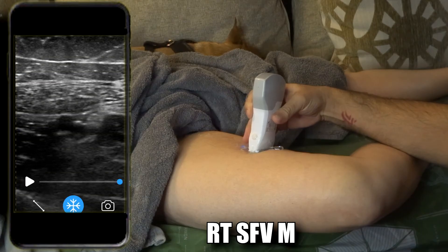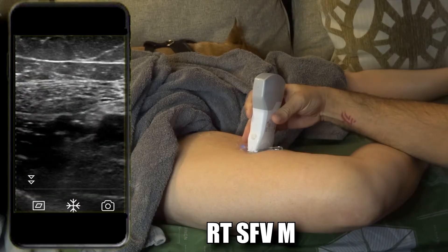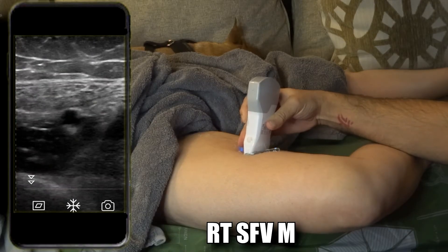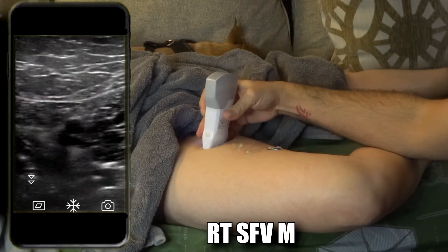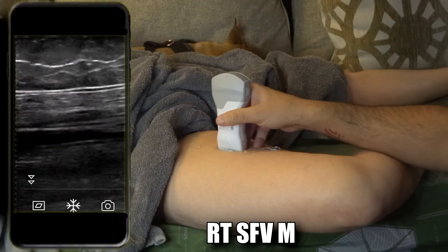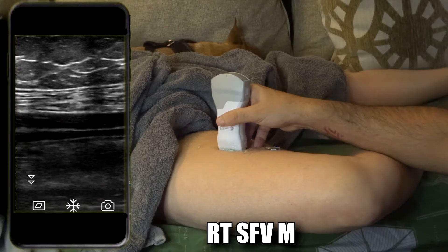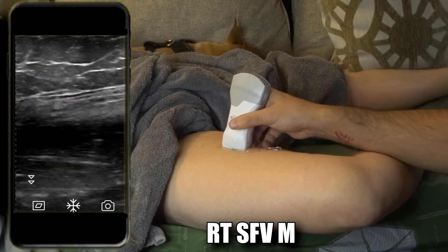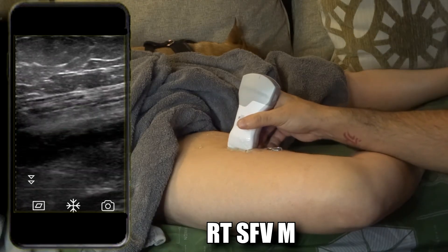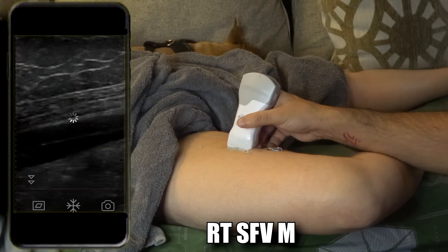Add a little TGCs, freeze, take the image, compress, take the image, and then sagittal. Here we are on sagittal mid femoral vein. If you're perpendicular to the vein the color Doppler won't show well, so it's always good to perform a heel tilt with the transducer to give yourself a nice angle — that usually does a good job at getting a better Doppler signal. Freeze, take the picture. There you see the artery and the vein — the artery is more superior, closer to the transducer.